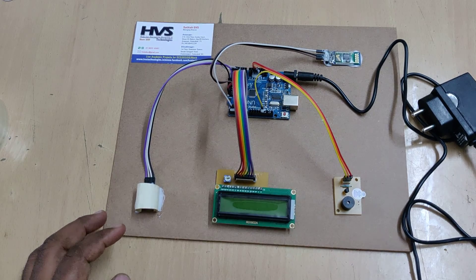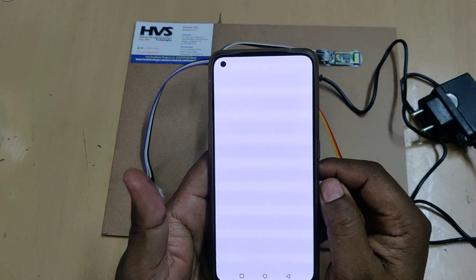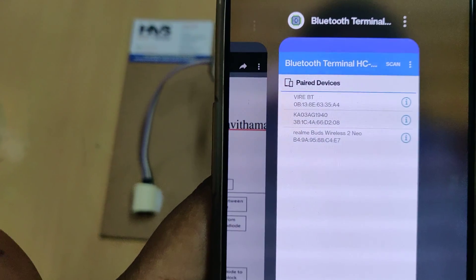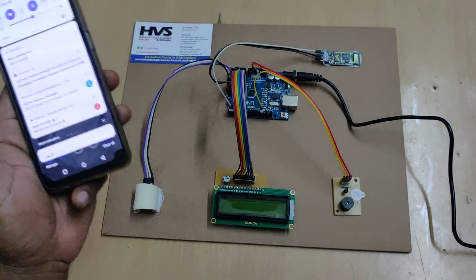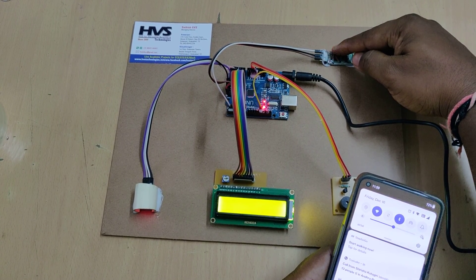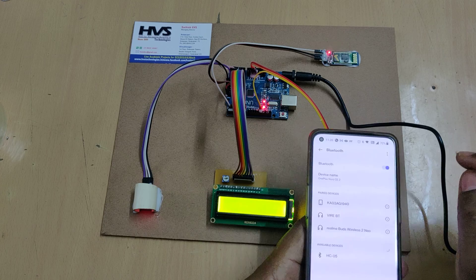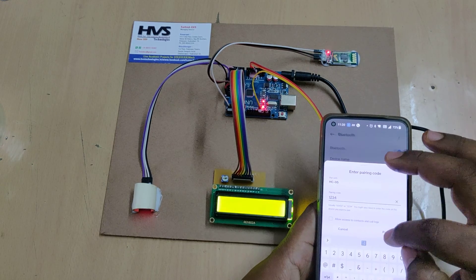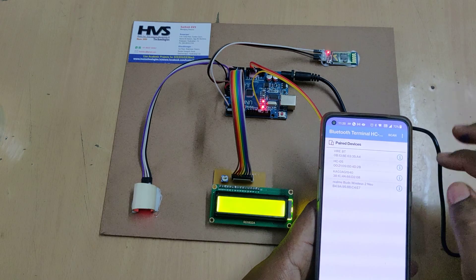Search for 'HC-05' in the Play Store — you will get the HC-05 application icon. Install that application, then power on the kit. The display will show the kit status trying to pair. Search for the Bluetooth module, which will show the HC-05 name. It will ask for a password — the password is 1234. After pairing from settings, go to the application.